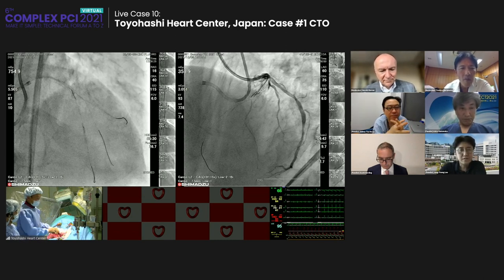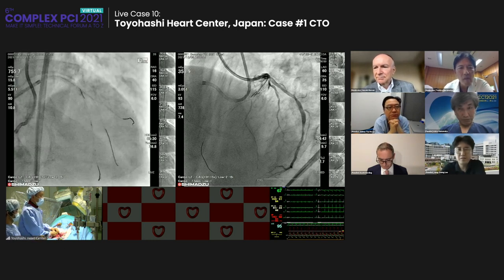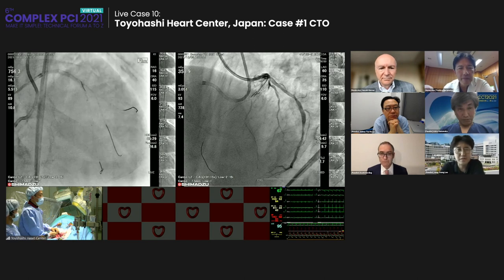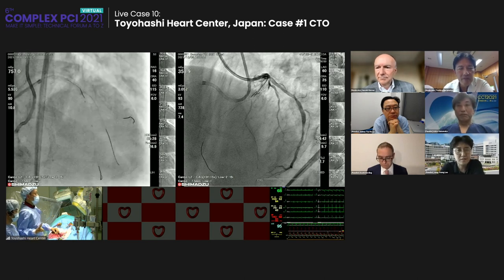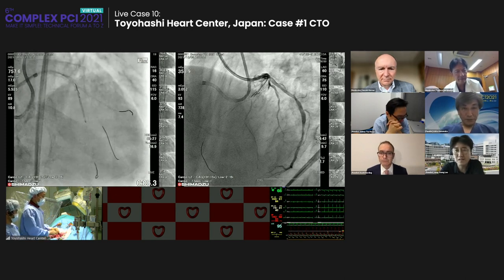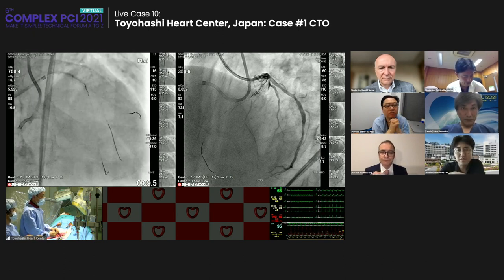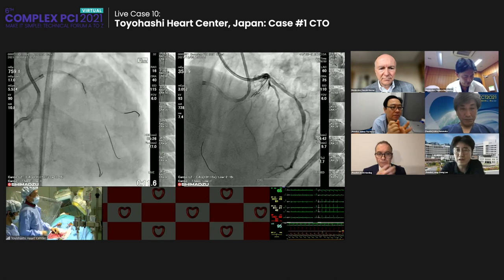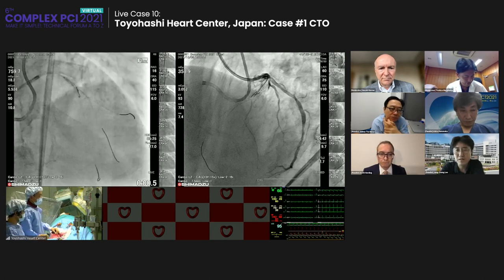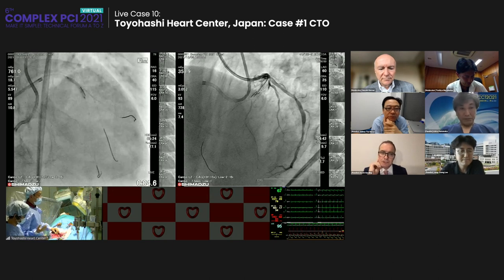In Korea, nowadays, the drug-coated balloon is getting higher popularity, especially in bifurcation and diffuse regions. So in my daily practice, a hybrid strategy such as using DES and DCB is also a good option, because stenting in the main branch and drug-coated balloon in the diagonal branch may also be a good option, in my personal opinion.